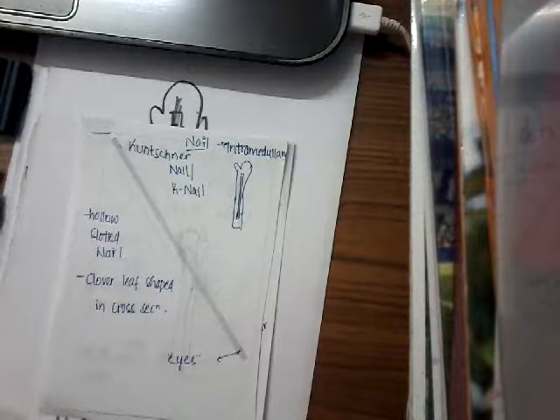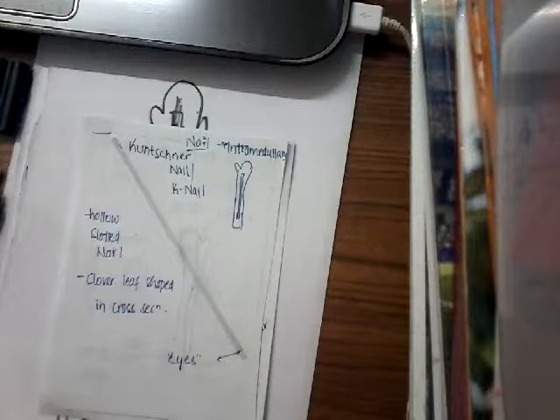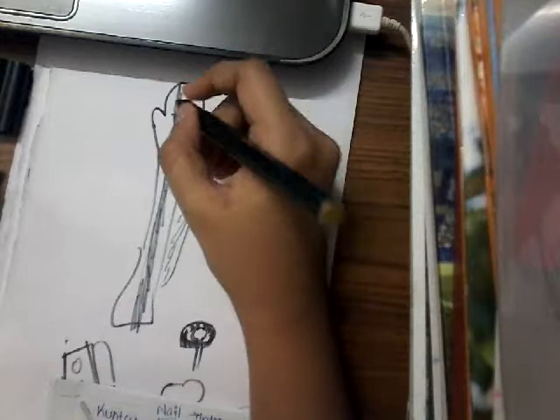So what is a nail? A nail is used for intramedullary fixation. Unlike a plate which is extramedullary, if we put something inside the medulla, that is called intramedullary.